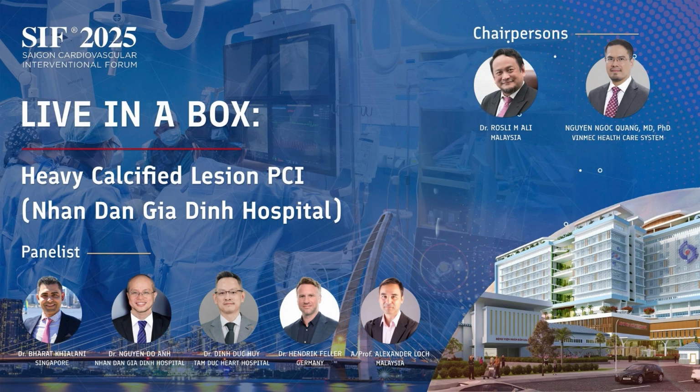Yeah, I couldn't catch the size of the left main. I thought it was going to be more than 4, I think. Yes, so sometimes if it's more than 4 and we would want to do another IVL, the biggest is only 4, it might not hold very well. So I would go for a non-compliant bigger balloon at least, 4.0 or 4.5, to see whether it cracks open.